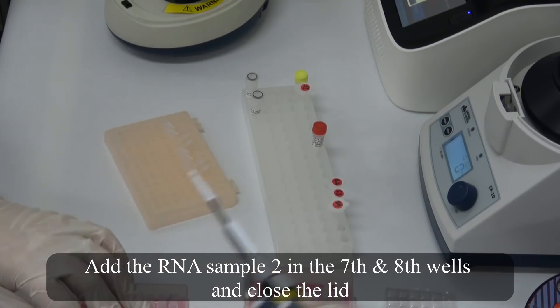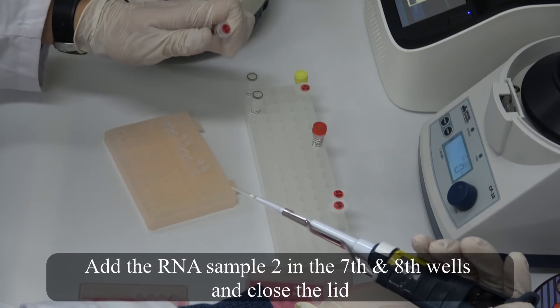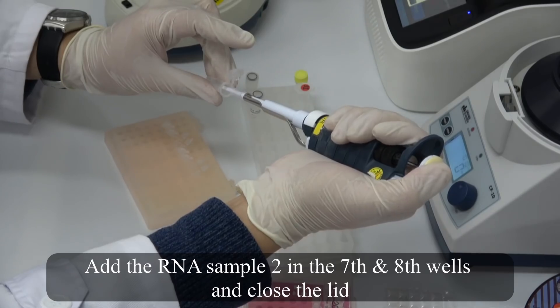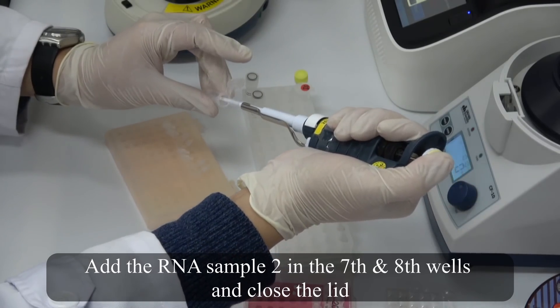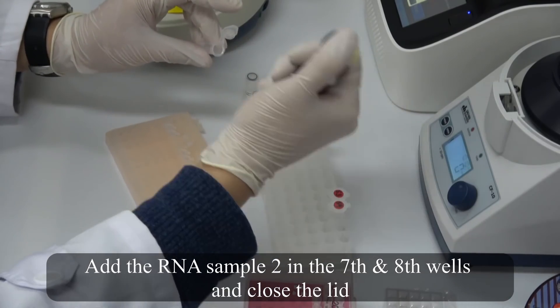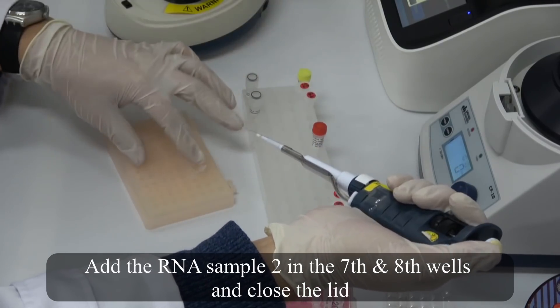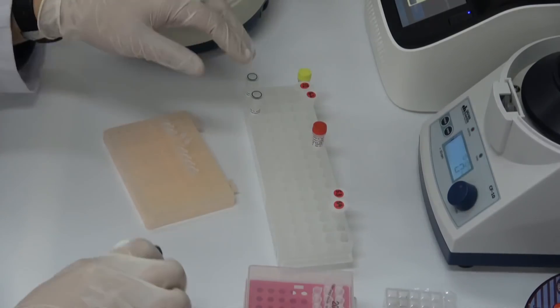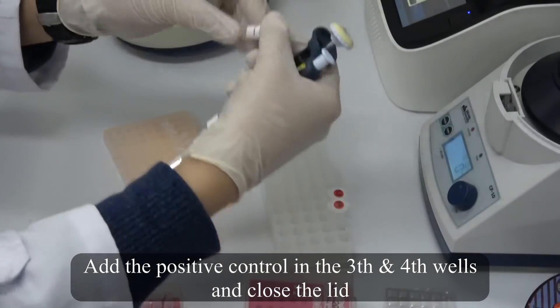Add the RNA sample two in the 7th and 8th wells and close the lid. Add the positive control in the 3rd and 4th wells and close the lid.